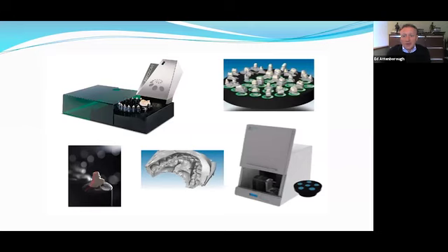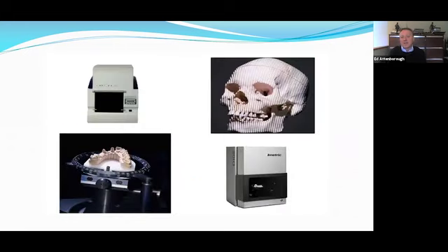The second technology that came a little bit later, in the mid-2000s, was called structured light. Same principle: we're projecting a pattern onto the object to be scanned. In this case, it's kind of like a barcode pattern. What we're using is the DLP light processor, from the same kind of projector that you would have for a PowerPoint presentation, and we're projecting a pattern of stripes or lines on the object. And then we're capturing that pattern with a stereoscopic pair of cameras, just like in the laser scanner. So we're looking at the pattern from 2 different angles.